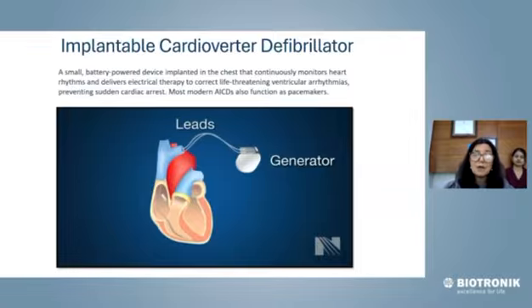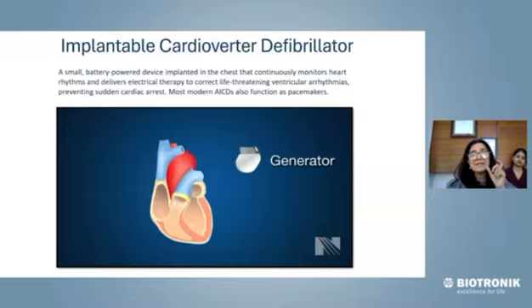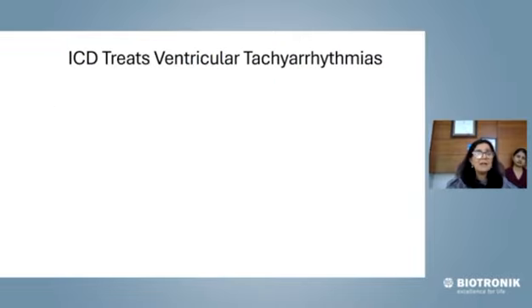There is always a ventricular-based single-chamber ICD, unlike in pacemakers. Also remember, they are not to be called AICD. They are called ICDs. While AICD implies automatic internal cardioverter defibrillator, it is a patent of a specific company and maker. So always refer to it as ICD.